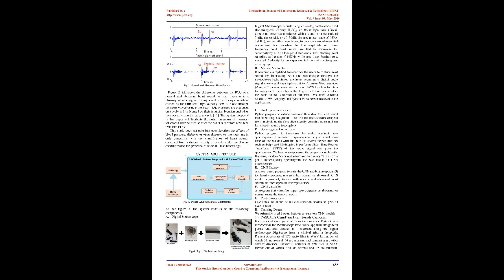B. Mobile application. It contains a simplified front-end for the users to capture heart sound by interfacing with the stethoscope through the microphone jack. It saves the heart sound as a digital audio signal, .wav, and then uploads it to Amazon Web Services, AWS, S3 storage integrated with an AWS Lambda function for analysis. It then returns the diagnosis to the user, whether the heart sound is normal or abnormal. We used Android Studio, AWS Amplify and Python Flask server to develop the application.